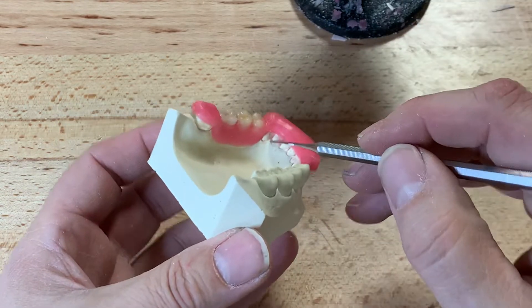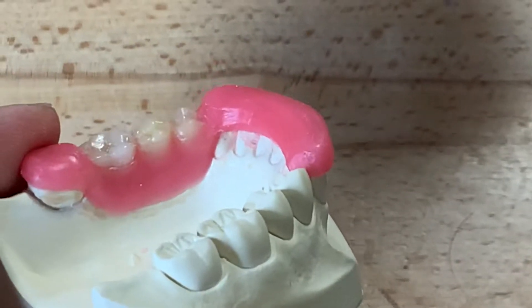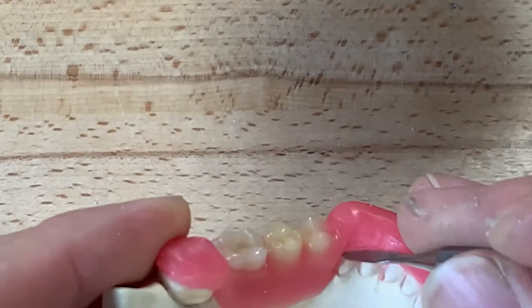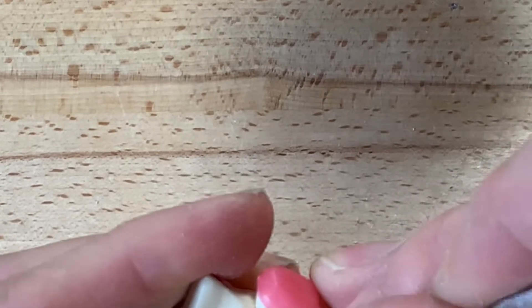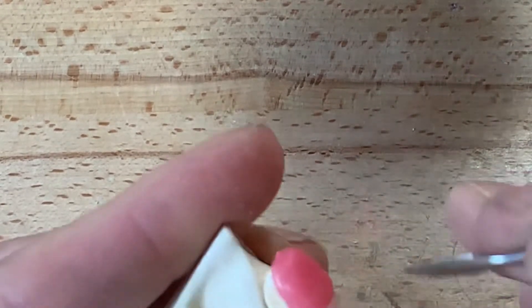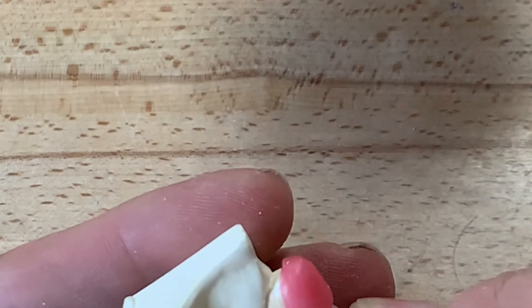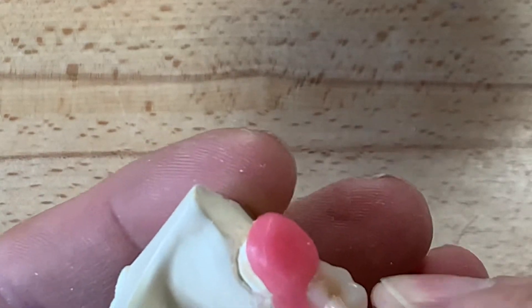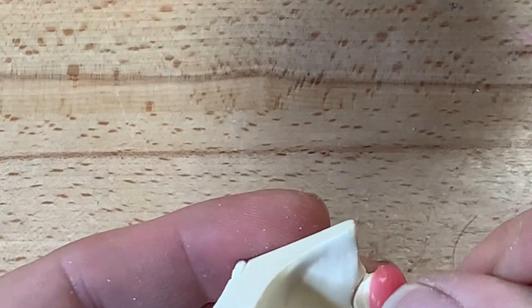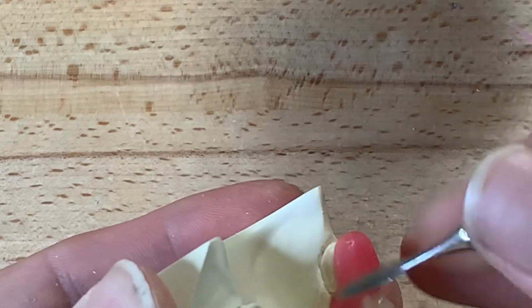As you can see, I've covered over here the canine on the lingual side, and I'm going to reshape this whole lingual section to create full contour anatomy for four, five, six, and seven. Whether you choose to do this now or after deflasking, you can shape these. Generally I'll do it after, because it's quick and I have more bulk deflasking, so there's no fracture.